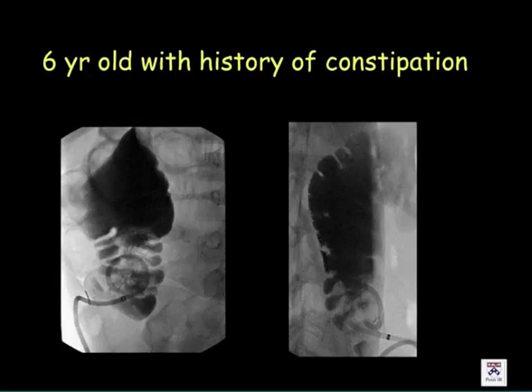Guys, more questions? I actually have one. I was just reading through your guidelines, and you were saying that there was a possible delayed complication of tumor seeding. What's your personal opinion about that, using the tube? Tumor seeding from the tube is clearly a real, absolutely documented complication. I have two patients. It's horrible. Patients have been cured of cancer and developed a huge metastasis on the abdominal wall with a tube eroding through this mass. It's really not fun. It can be avoided by not using the transoral approach in all ENT or esophageal cancer patients.